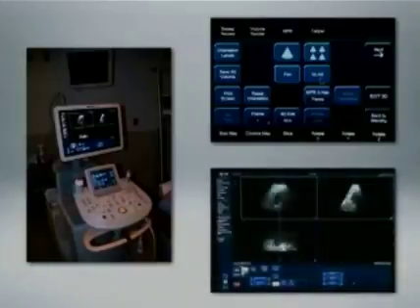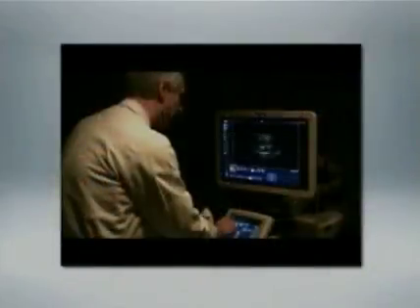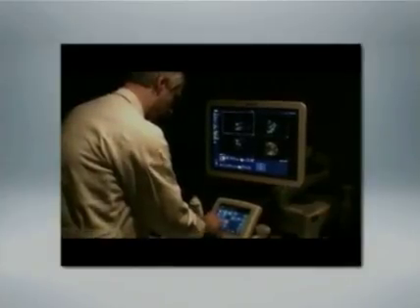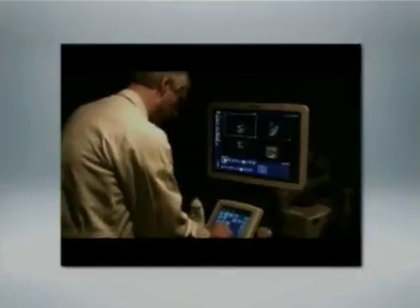If you hit that button, what you see on top is this display, and you can then interact with QLab to get whatever you want. And this is how it looks in actual practice. This is me manipulating a volumetric data set on the machine itself. Again, similar to the workflow that we sometimes use in CT.